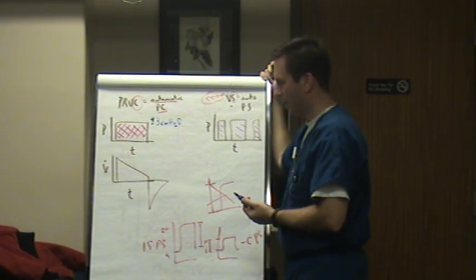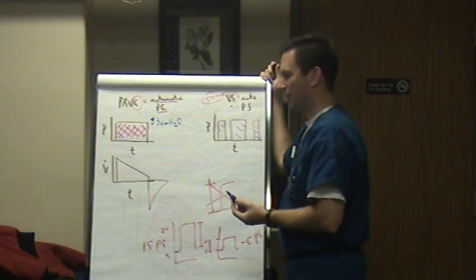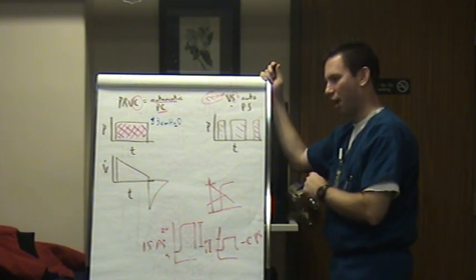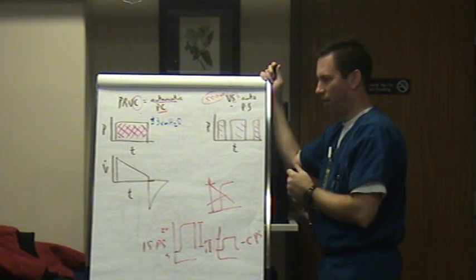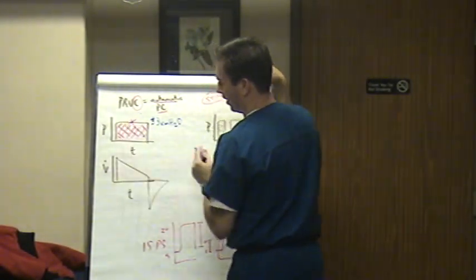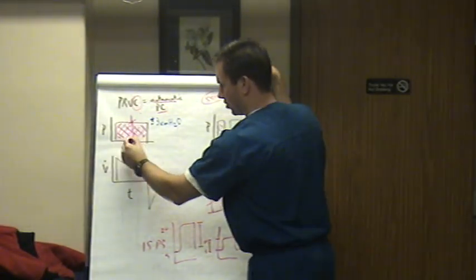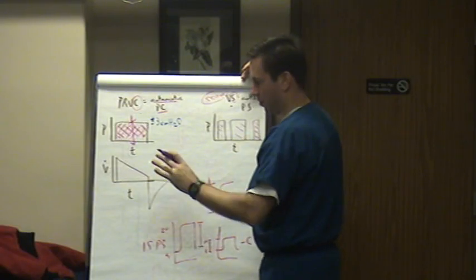Y'all probably seen that before. And you're like, well, crap, what's the best thing to do? You have an option to allow them to be just sedated and not paralyzed and breathe over on APRV and bi-level, and I'll show you why. If they cough right here on PRVC, if they cough or fight it, it actually pressure limits and cycles off. The vent breath is terminated.